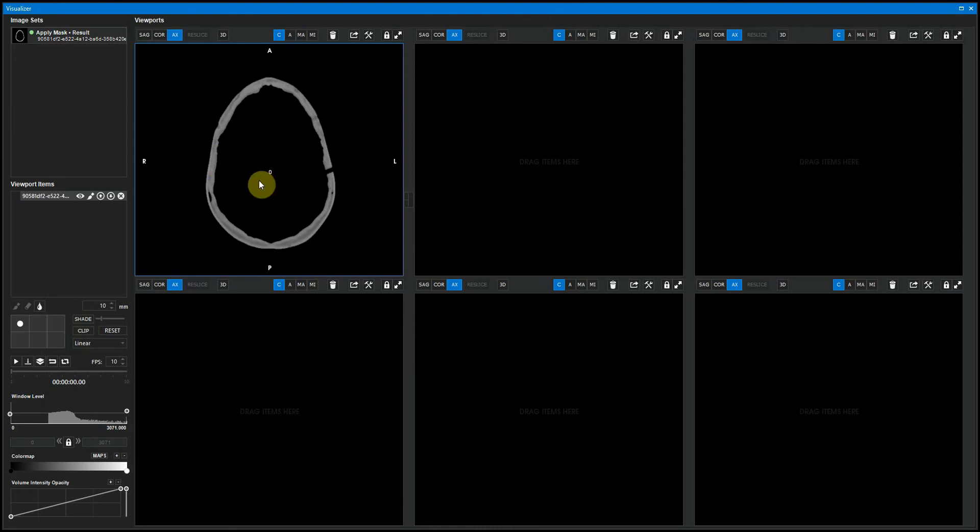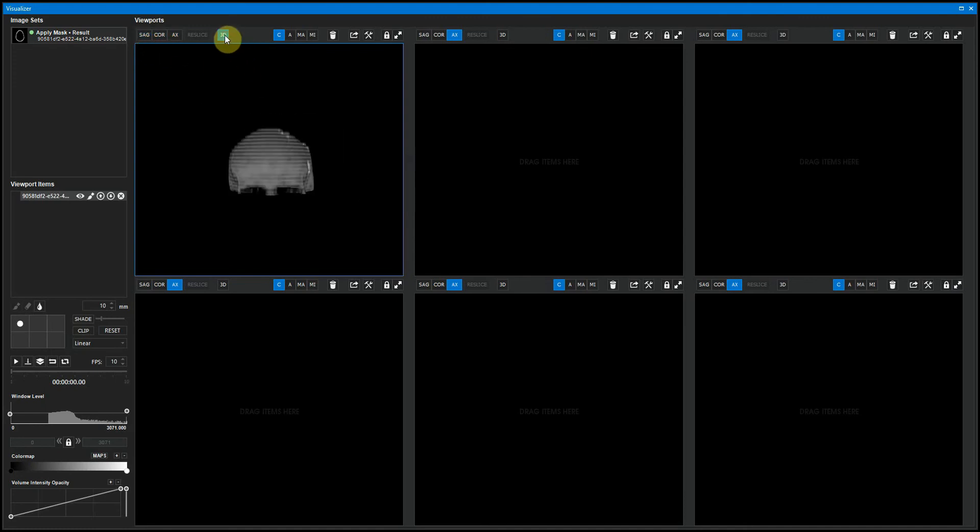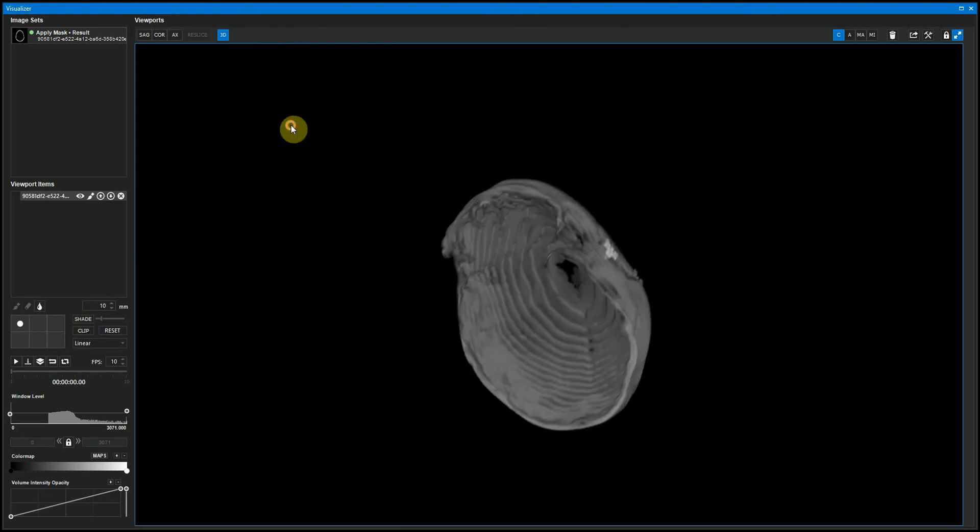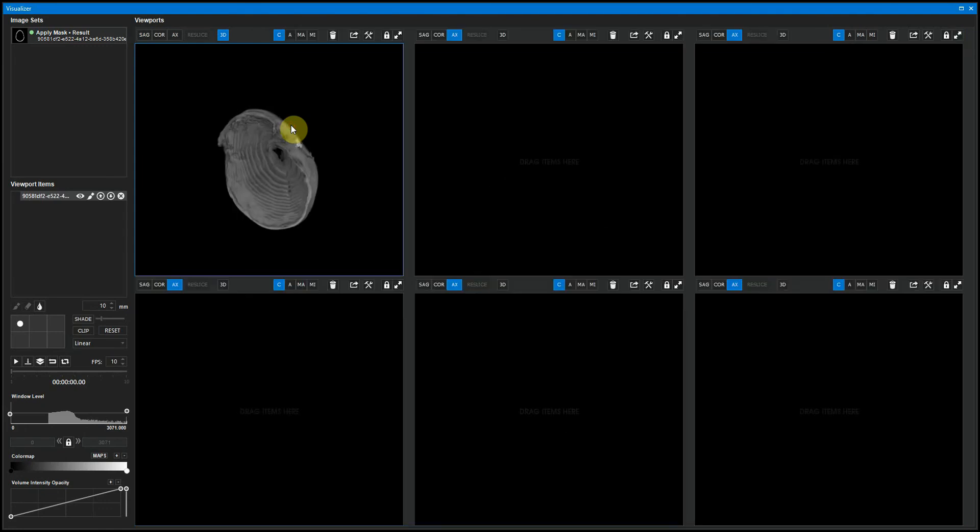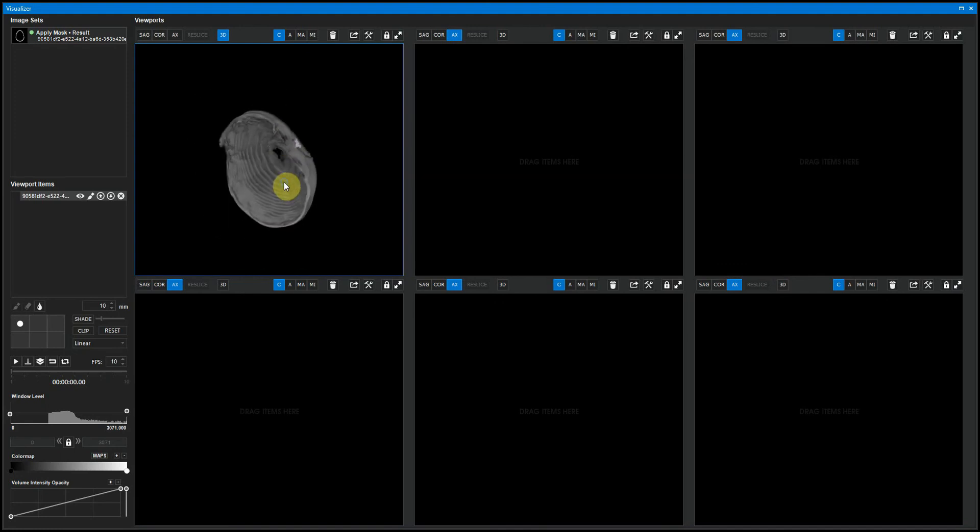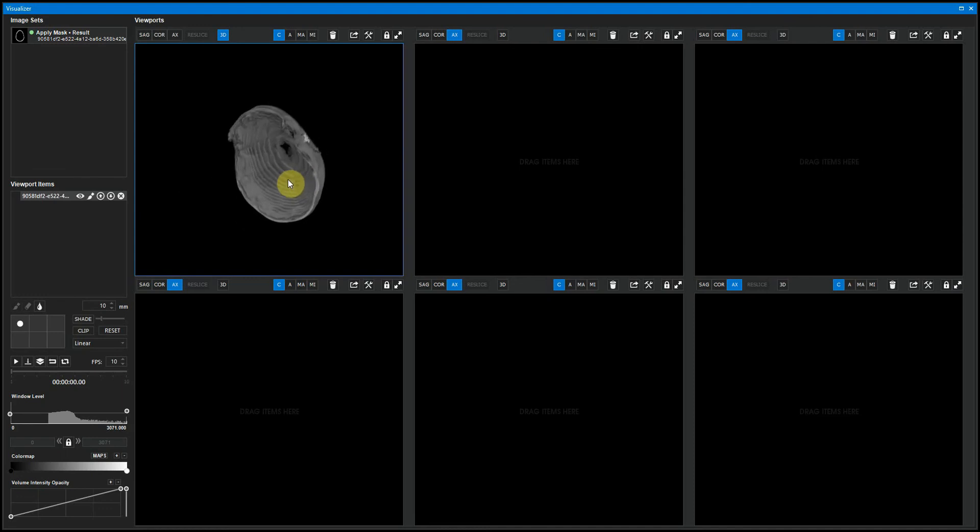We can also view the image in different directions. We can see a coronal view or a sagittal view. We can also view the image in three dimensions by clicking the 3D button. We can rotate the image by drag and dropping. By double-clicking in the viewport, we can zoom in to make the viewport the entire screen. And by double-clicking again, we can go back. We can use the right mouse button to zoom in and out in the image. And we can use the middle mouse button to pan the image. We also see that we have a histogram here. So we can see the distribution of the voxel values in the selected image.